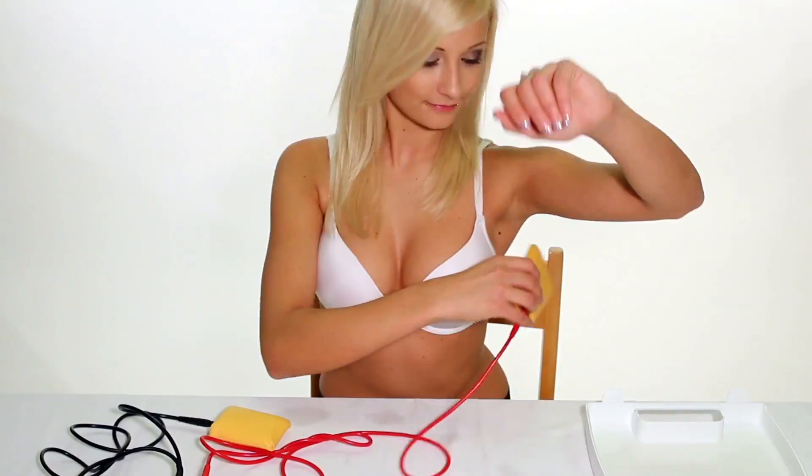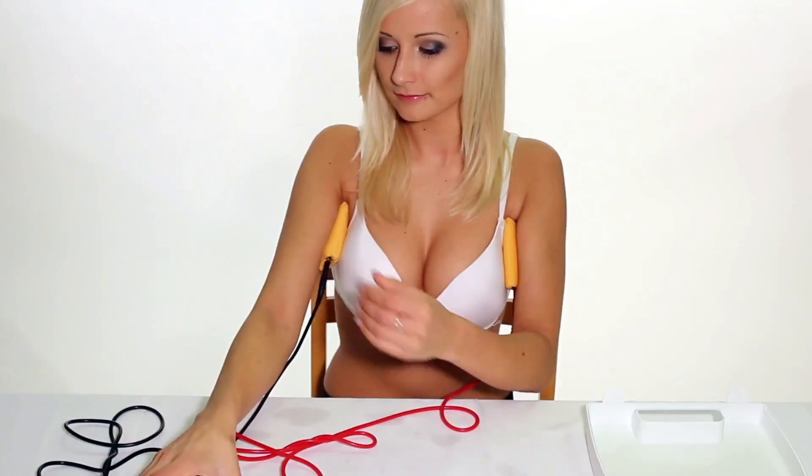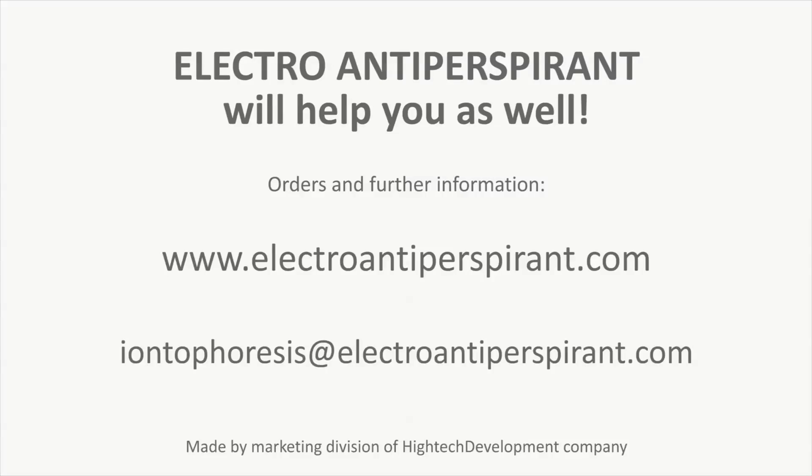Once everything is ready, insert the electroantiperspirant comfortable adapters in your armpits and you can begin therapy according to the manual. Electroantiperspirant will help you as well.